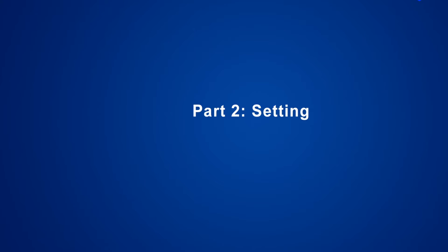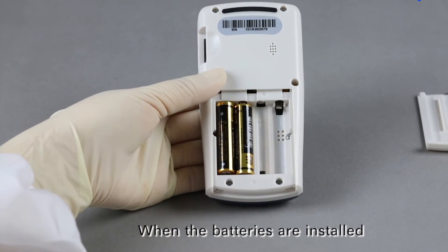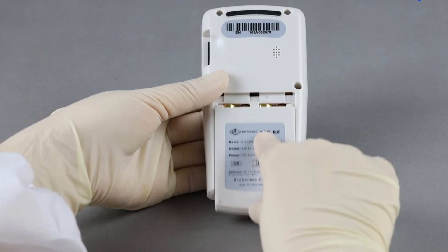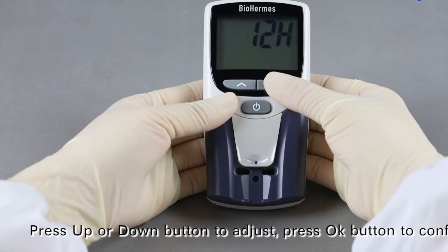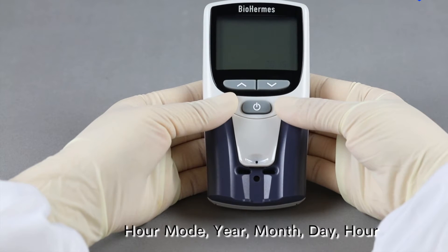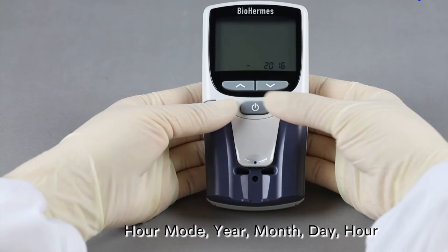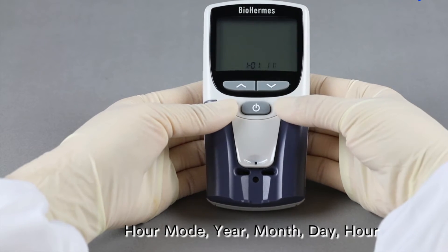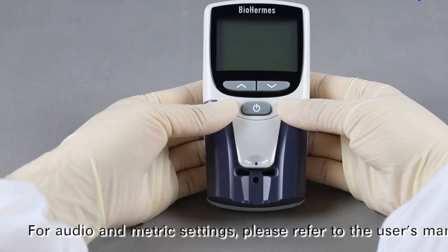Part 2: Setting — Date and Time. When the batteries are installed, the analyzer will automatically switch on and enter into the setting mode. Press the up or down button to adjust, and press the OK button to confirm. Set the hour mode, year, month, day, hour, and minute successively. After setting is completed, the analyzer will automatically switch off. For audio and metric settings, please refer to the user's manual.